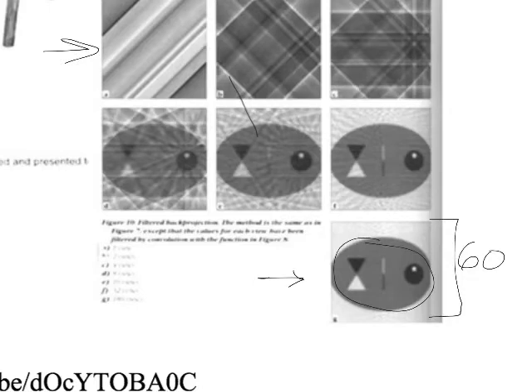And one thing to stress with image data is that the process of moving from raw data to image data is an iterative process, a repetitive process. One of the things it's trying to do is interpolate. This is another $5 word, interpolate. I'll write it down. Interpolate.